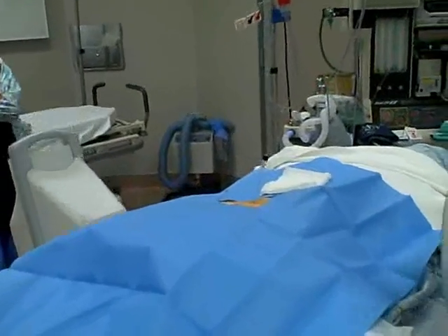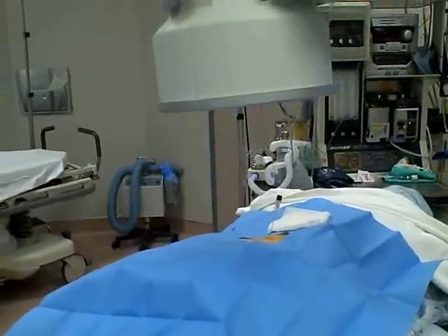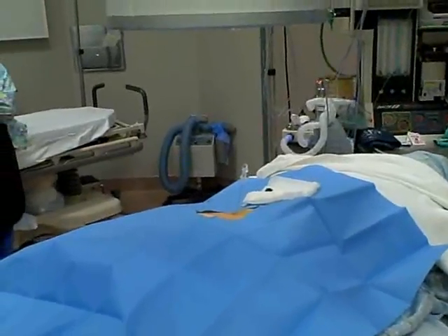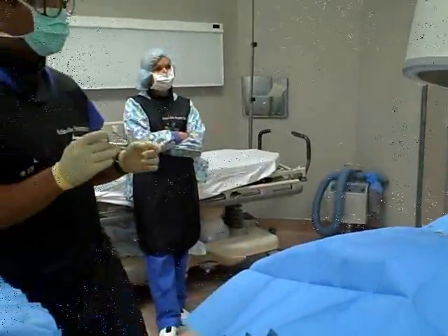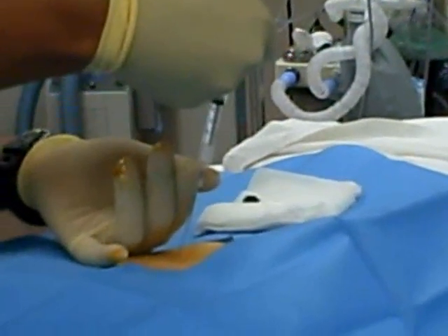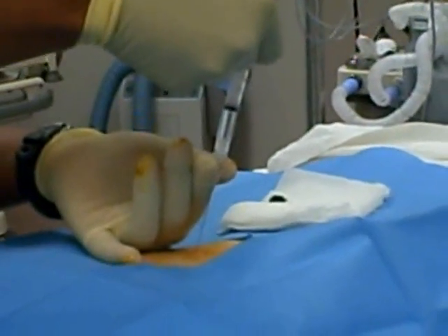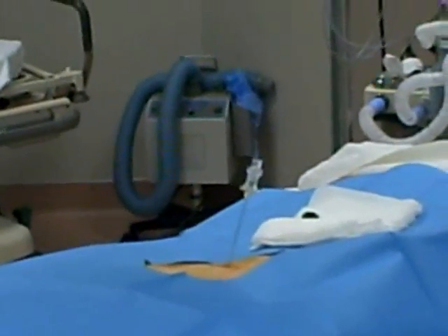When satisfied that the tip of the needle is in that very precise target region, we inject a little bit of contrast material to confirm needle placement. Now, this will tell us that the steroid solution we're going to inject next will spread exactly where we want it to spread. It'll also help us identify any evidence of nerve compression or abnormalities within the epidural space.